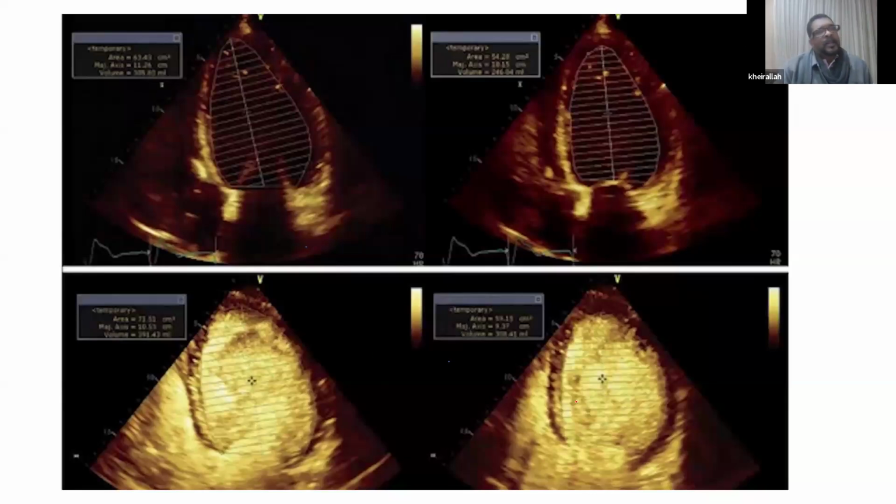Like, what is this here? This is the use of contrast. Contrast. You look at this here, before and after contrast. This is called ultrasound enhancing agent, UEA, ultrasound enhancing agent, like Sonovue, Optison, Definity. These are all ultrasound enhancing agents.